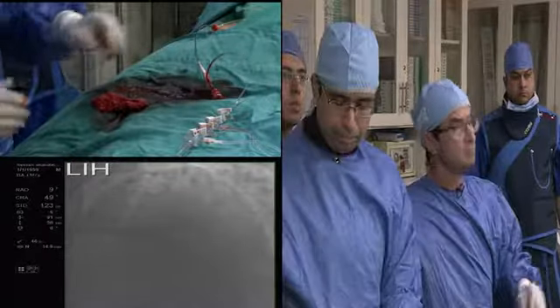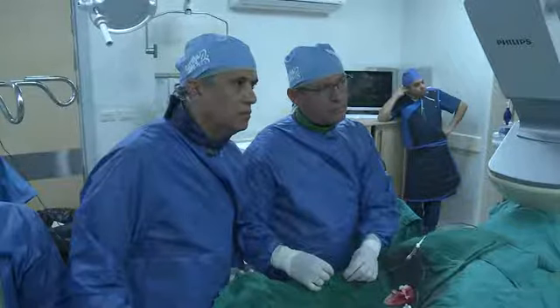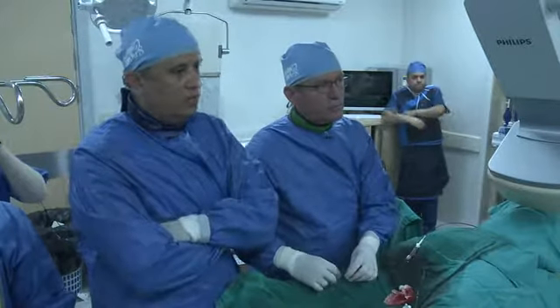Okay, now we first do an angio. We first do an angio, please. Are you ready? Yes. So, I don't know what happened with the wire. Dr. Sobhi, can you see us?